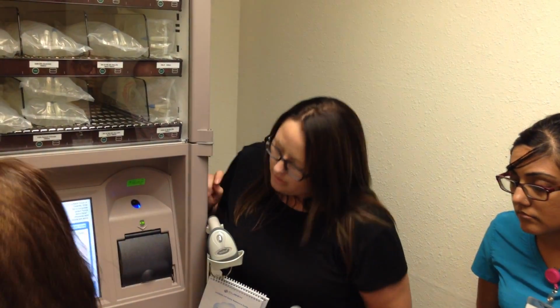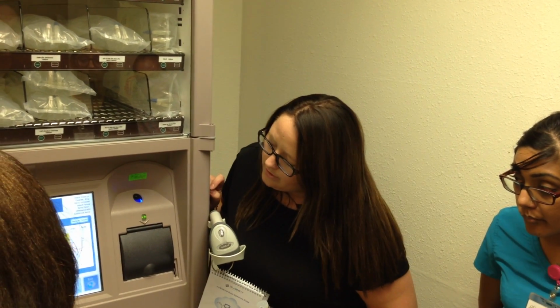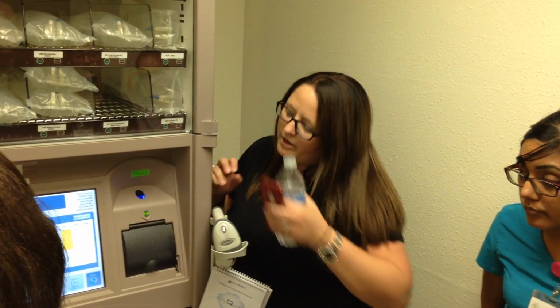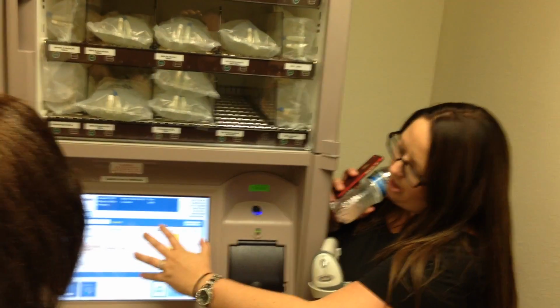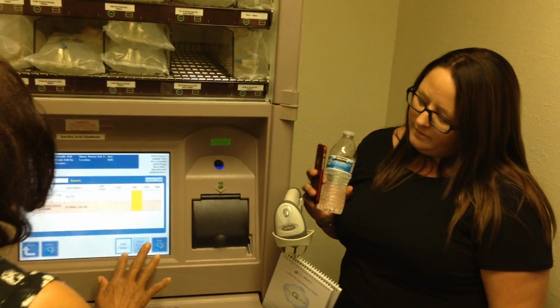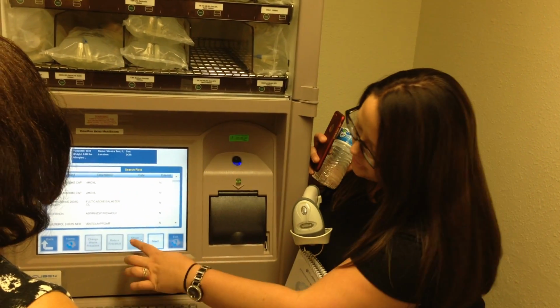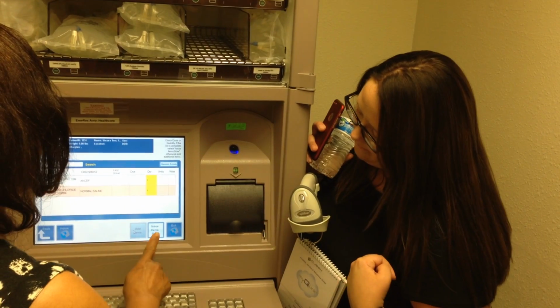Okay. All right. After you've verified that everything is correct, so you'll have the patient name up here, you've verified that the patient's information is correct, all of this is correct, everything's good, you'll hit issue items now. Oh, go back to show item list. We're going to hit issue items now.